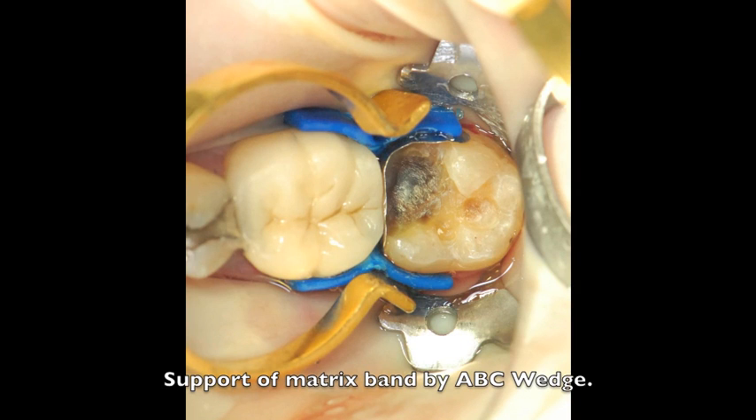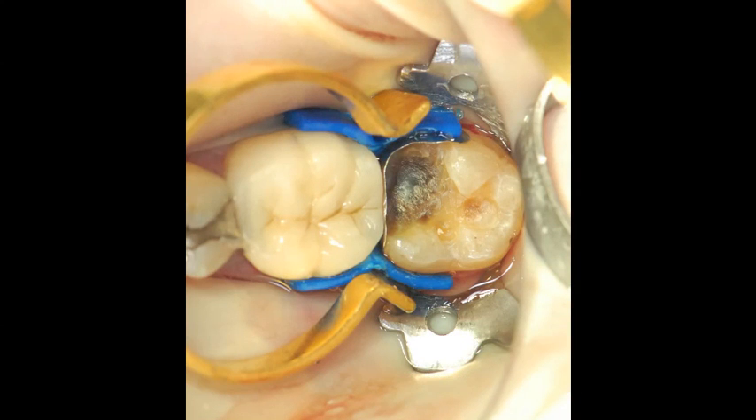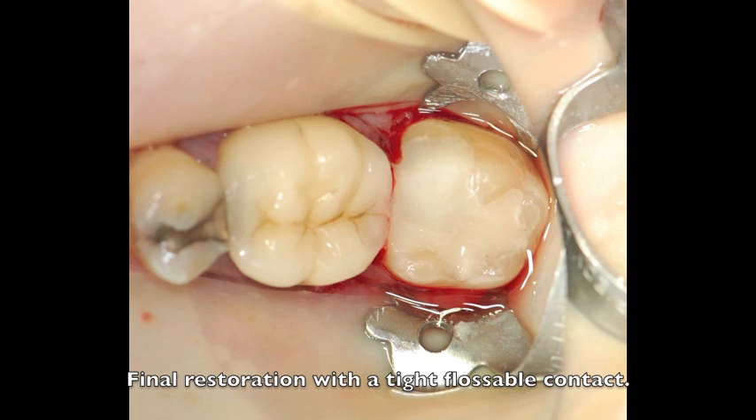While utilizing the ABC wedge, we can now place that wedge between the teeth, sealing off the gingival floor. The wedge itself forms a wall, a support, so that when we place the separating ring on top of the tooth, it no longer crushes the matrix band into the preparation. Here you have the final restoration, showing the ideal form and function with an ideal, tight, flossable contact.